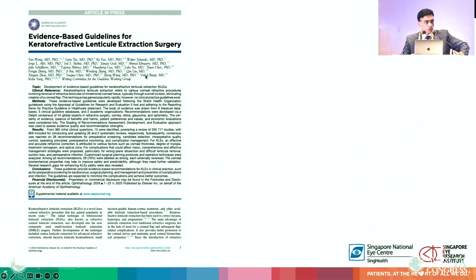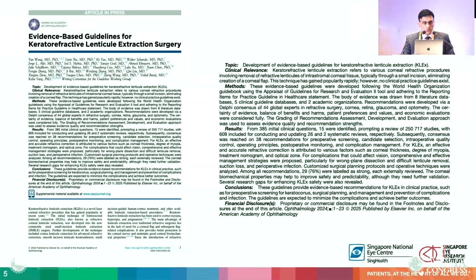Last year, I was part of a consortium that published guidelines in Ophthalmology, looking at evidence-based outcomes for KLEX surgery. This is something for those of you who don't do KLEX at the moment but are interested in undertaking this procedure. It was done as a Delphi panel of 44 KLEX surgeons. Essentially what we tried to do was come up with guidelines for preoperative assessment of patients, intraoperative management, management of complications, and postoperative outcomes. This paper analyzes the viewpoints of many surgeons around the world and how they manage KLEX. And really this applies to all platforms, whichever ones you have.